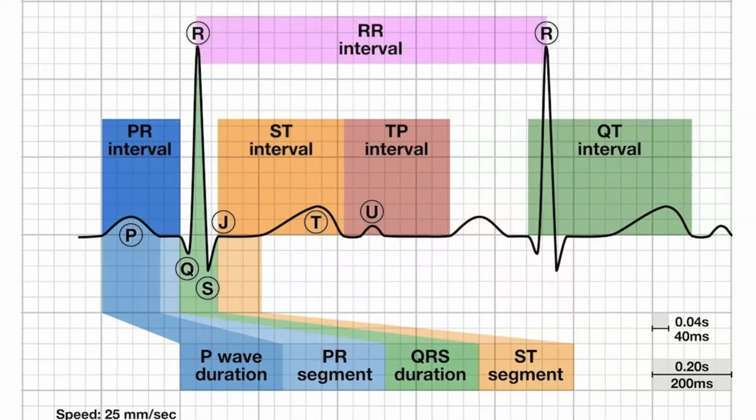Now I'm going to go through each of these intervals, each of these waves, and talk a little bit about them. I'm not going to go too much into detail about the clinical applications of them in this talk, but that will become relevant in next week's talk for ECG Part 2, where the common arrhythmias and rhythms and all the things that you should know or aim to know by the time you qualify will come to share upon, and I will relate some of this background knowledge to that then.